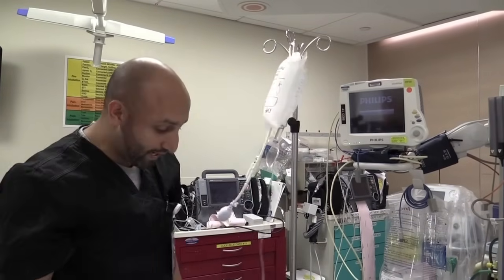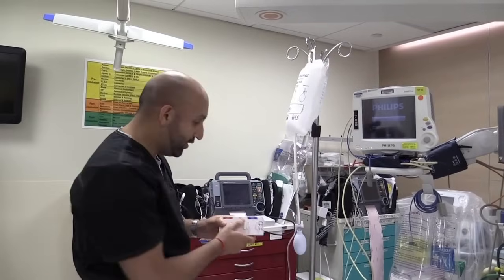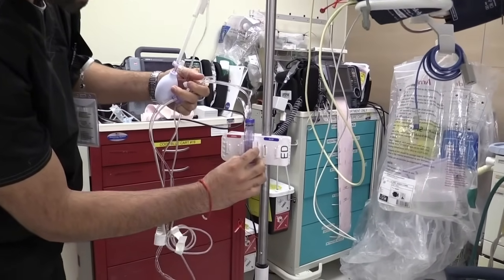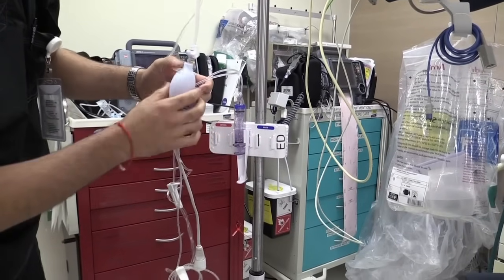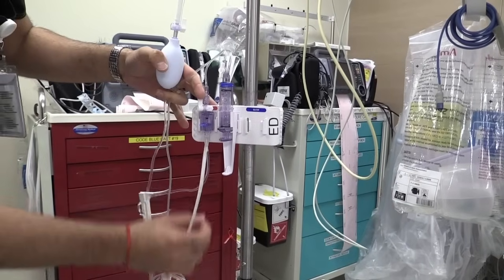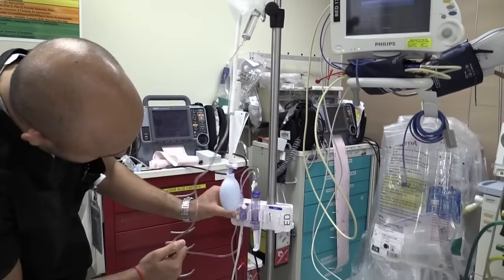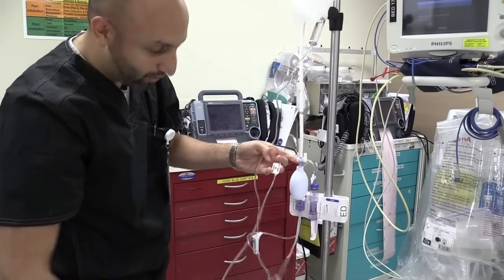Step two is placing everything on the IV pole and getting all the air out of the line. We're going to need our transducer holder — place this onto the IV pole. Then take our setup and place it onto the transducer holder. The syringe fits right into the middle section and slides in. Make sure you put it upwards so you can read all the numbers clearly. Take your transducer and place that into its slot and slide it down, with the cord facing downwards. Now you have a setup with the pressure bag tubing going down into the transducer, from the transducer to the syringe, and from the syringe to the patient.